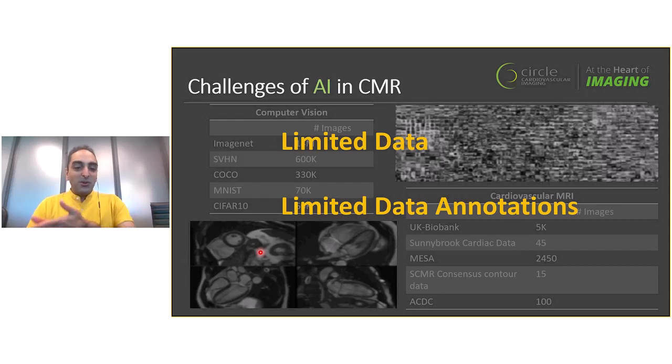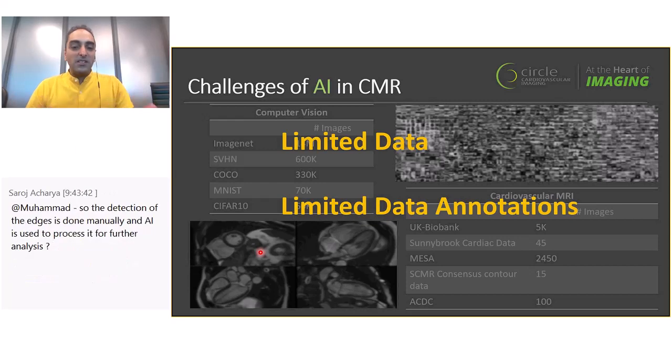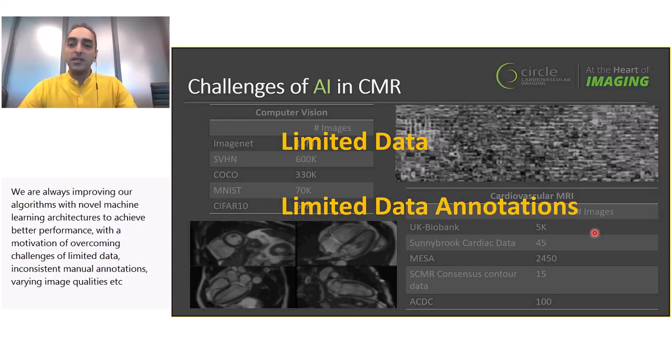But when it comes to medical images, you need someone who's expert enough to be able to tell the difference between different structures, anatomies that we're hoping to automatically extract. And some of these anatomies become really difficult, even with the function contouring. When you get closer to the valve planes, it becomes really tough to manually annotate these cases correctly.